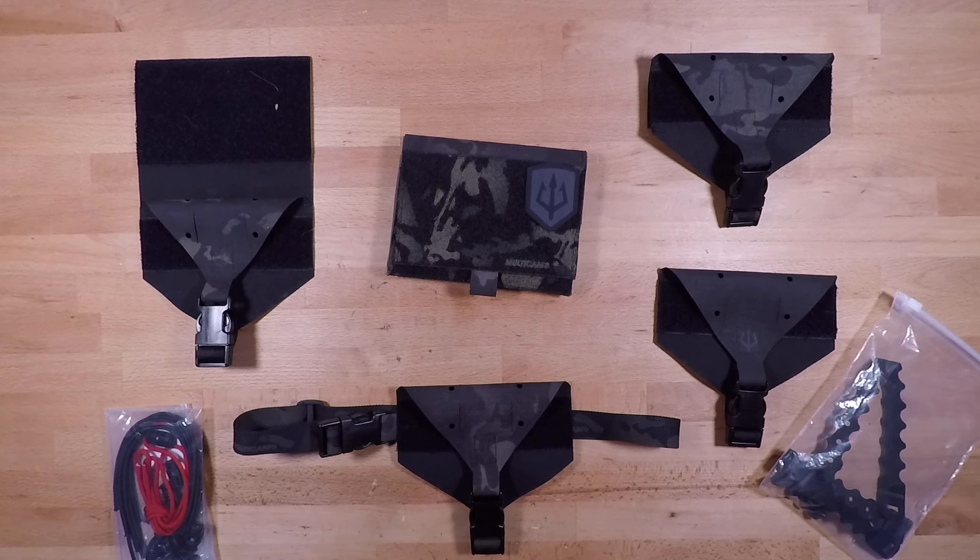Welcome back to another gear review. In this video we're going to be going over the Black Trident Trauma Burrito med kit system. Black Trident is a tactical company out of Europe — they're from Austria — and they're primarily composed of active duty and former European SOF guys as well as a handful of American SOF guys. Collectively they've come together, taking all their experience both past and present, to design and develop equipment based off the needs of tactical applications in law enforcement and military.